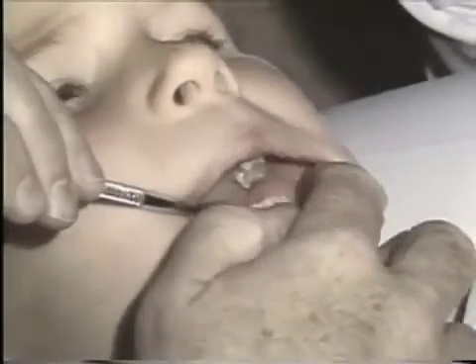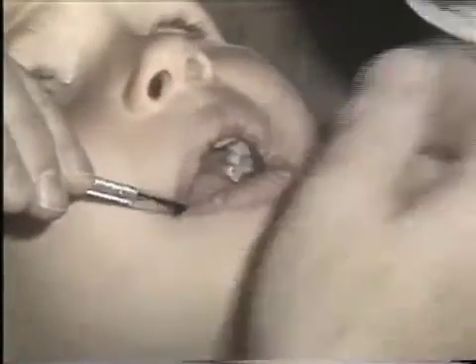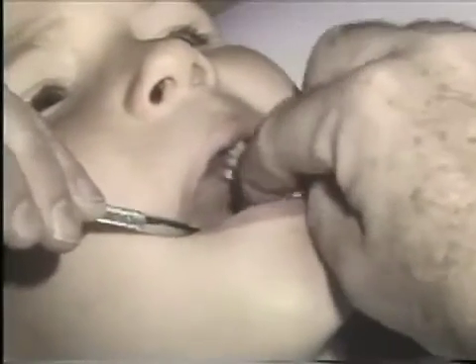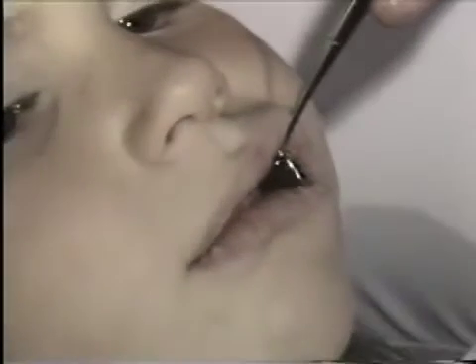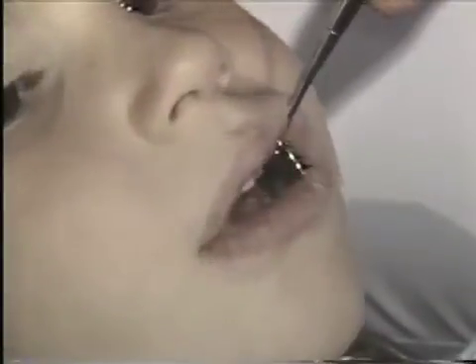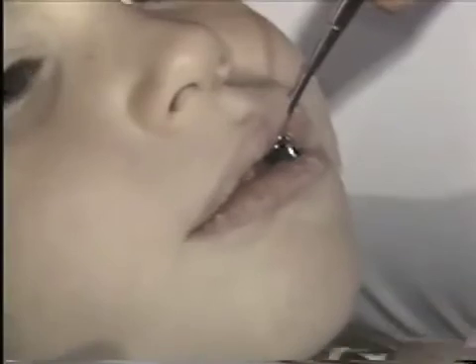Suction it out clean and dry the surface off well. There is a little remnant of the silex slurry that stays on the surface even with rinsing, so I like to moisten a cotton roll and scrub that surface off as well. Then we'll re-rinse and dry the surface again, prepared now to place our isolation in preparation for the etching procedure.